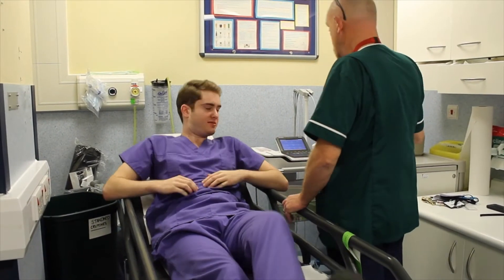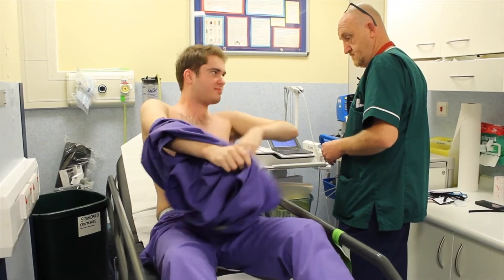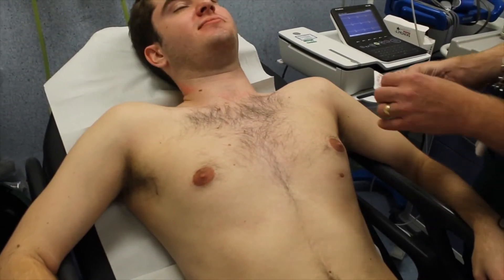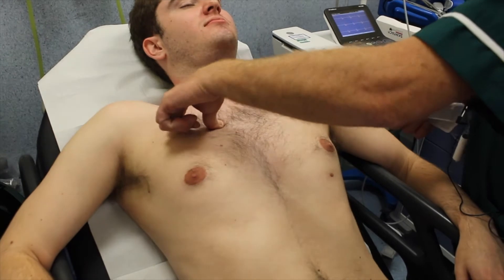Okay Jack, would you like to remove your shirt? Yeah, okay. So what I need to do is place six sticky electrodes onto your chest.